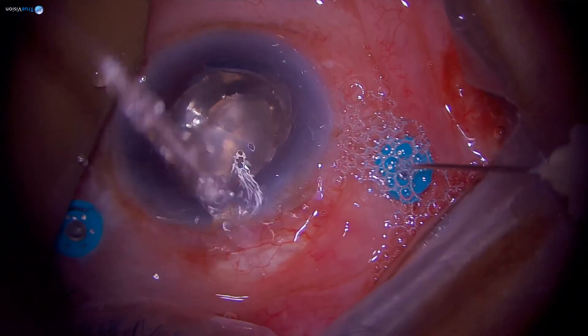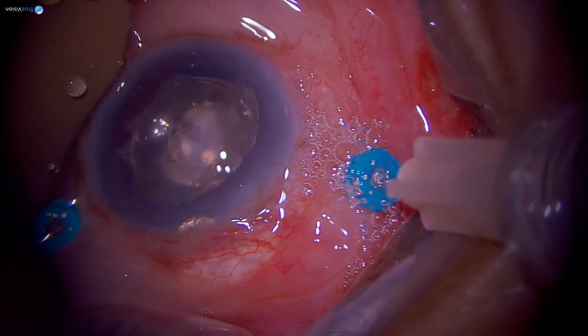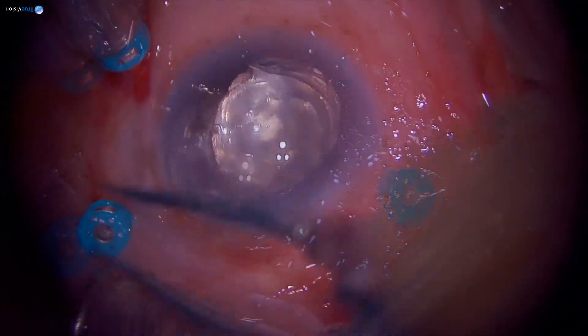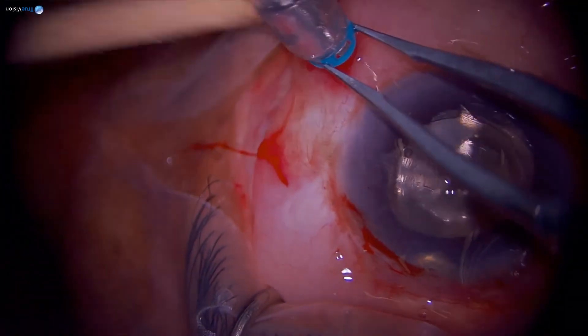Key lessons from this case include being gentle with tissue and ensuring good visualization throughout. At the end of all my vitrectomies I perform an air-fluid exchange — it's a partial exchange mainly to secure the wounds. With sutureless vitrectomy, having saline inside means the wounds can be a bit leaky, so the air bubble helps keep them secure.